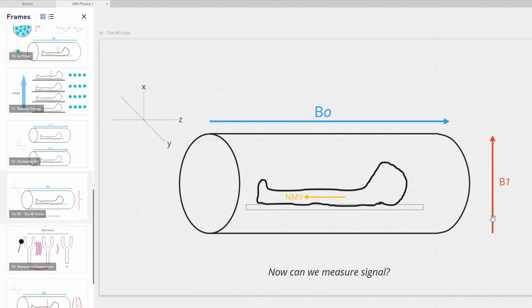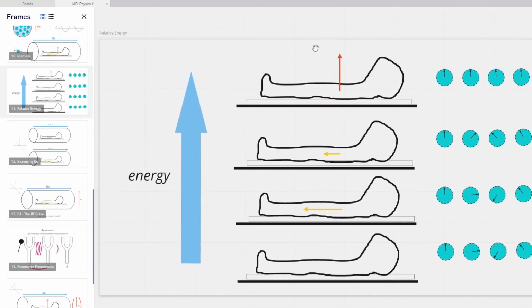The reason is that even though it's in some other direction than our resting magnetic field, if you just apply this field in a perpendicular direction, you're just going to do the same thing. You're just going to heat the patient up. For reasons we'll talk about in a second, you're not getting efficient energy transfer from this magnetic field. You would still have to basically cook the patient alive for this field to ever put enough energy into the system to get to this.